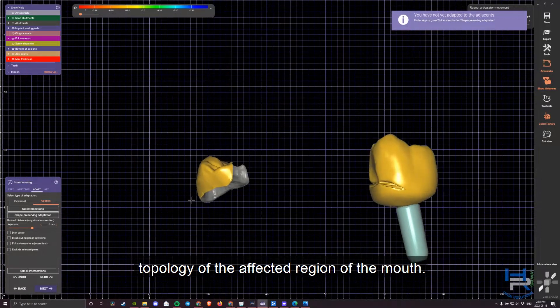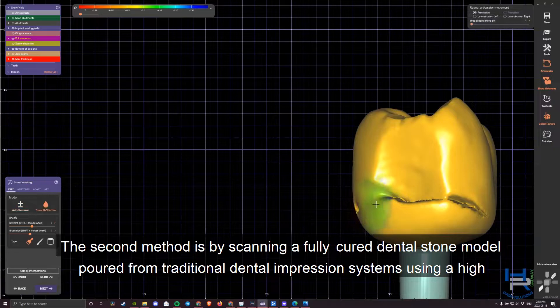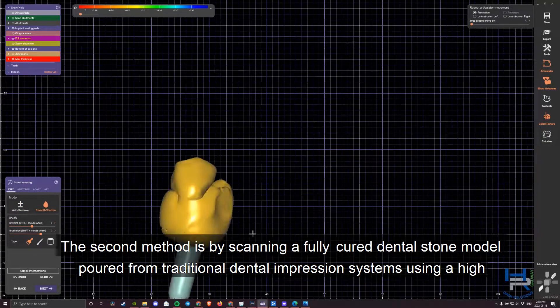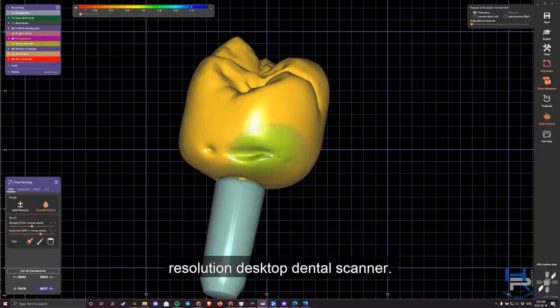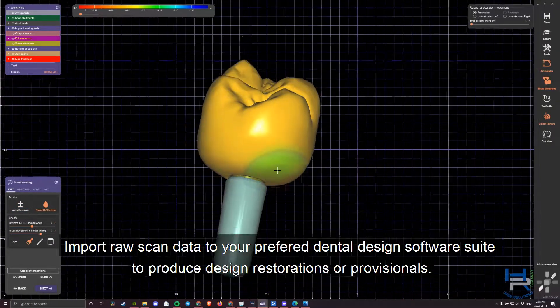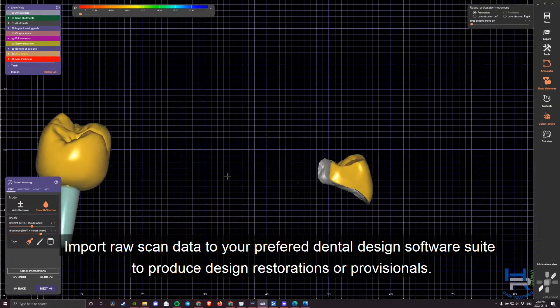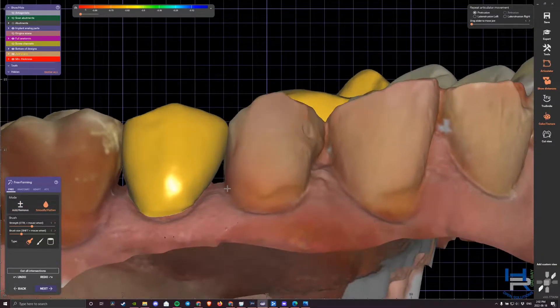The second method is by scanning a fully cured dental stone model poured from traditional dental impression systems using a high-resolution desktop dental scanner. Import raw scan data to your preferred dental design software suite to produce design restorations or provisionals.